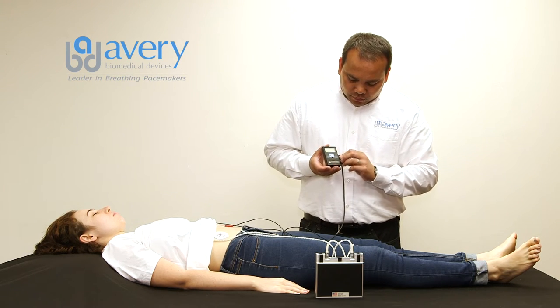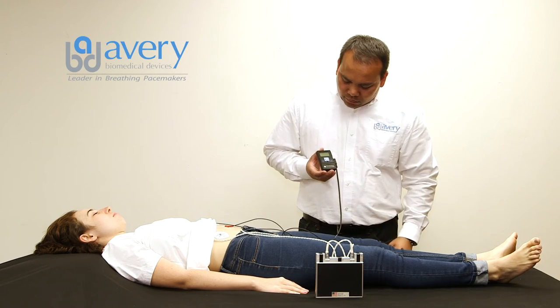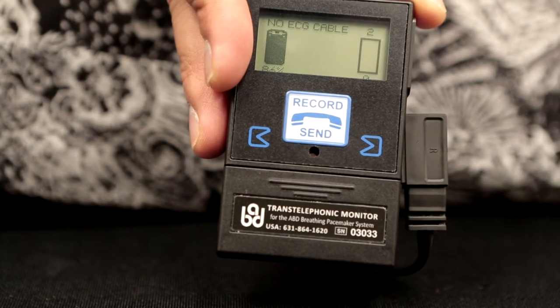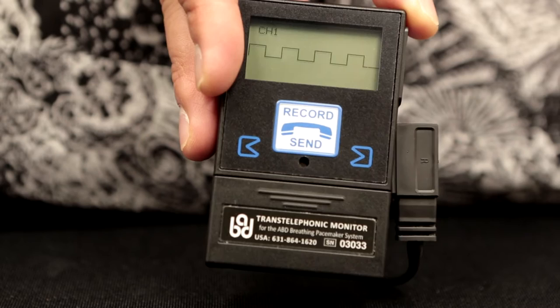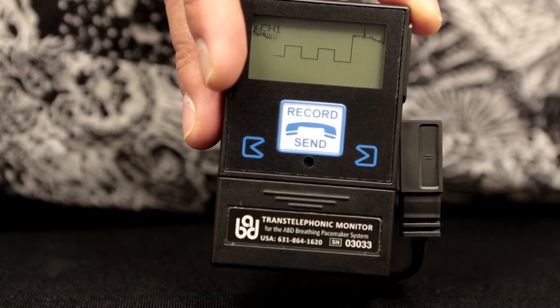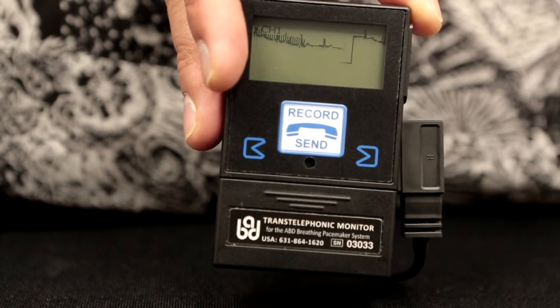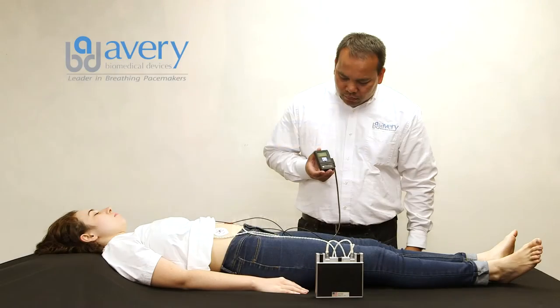If the snap buttons and the skin electrodes are well-placed and make good contact, the TTM will sound one beat. For a few seconds, the TTM display will show square waveforms and cardiac waveforms thereafter. If there is no good connection between the snap buttons and skin electrodes, or the skin electrodes aren't making good contact to the skin, there will be no beep and the square waveforms will continue to be displayed. When monitoring flashes on the display, recording of the left side signals can begin.